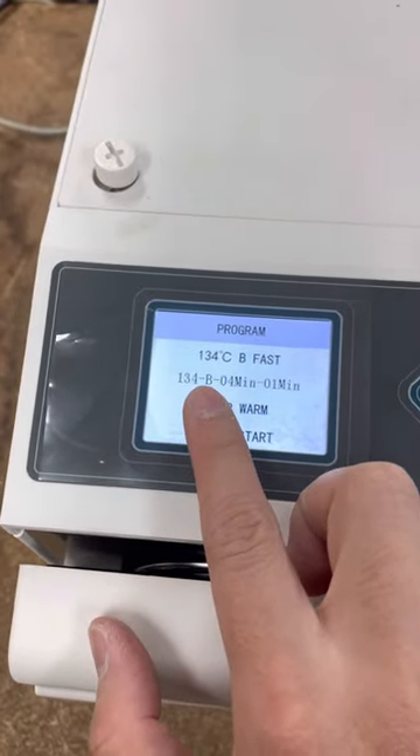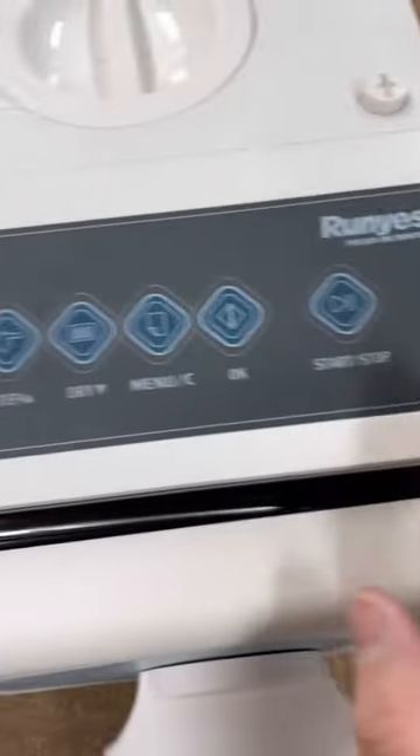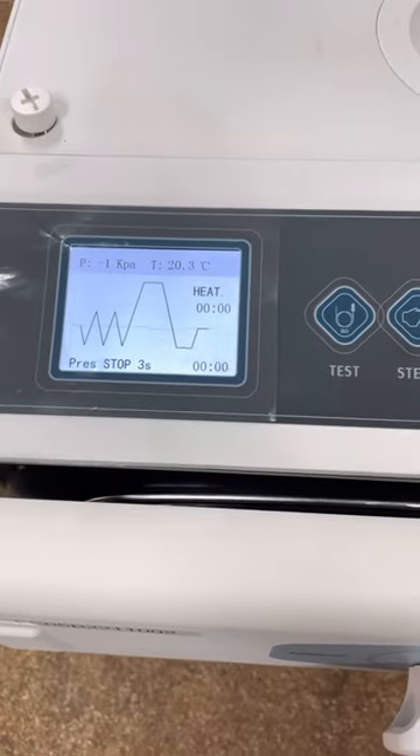134 degrees B sterilizes for 4 minutes and dries for 1 minute. Once you're ready, click on start and it's begun.